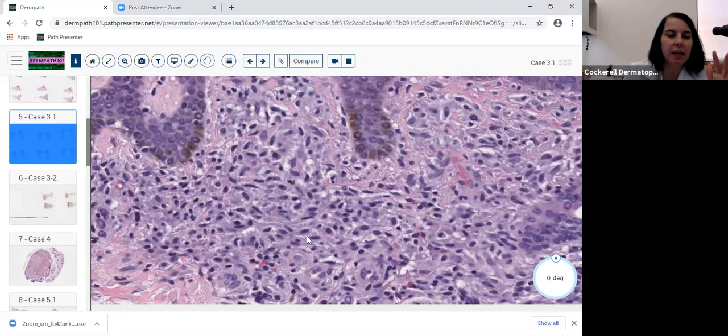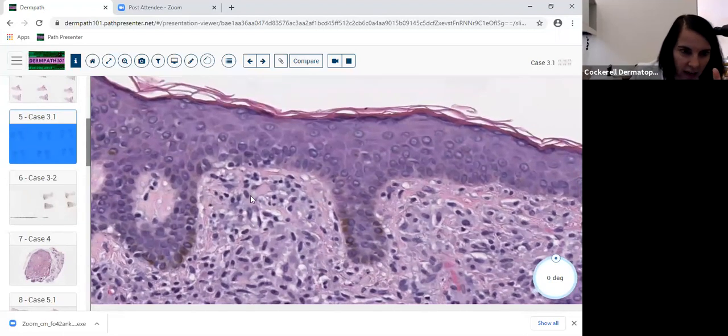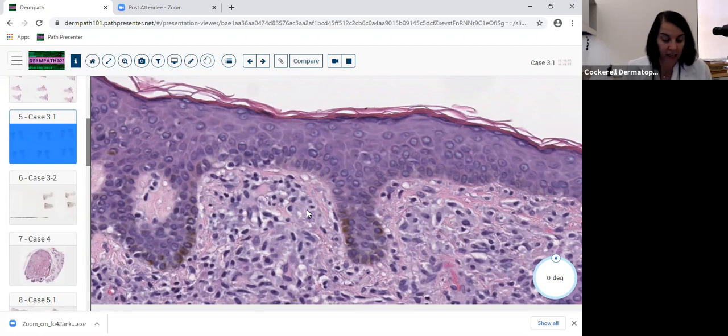And obviously you can see bullous lesions in children. You don't want to forget about the bullous lesions. Occasionally you'll see a cleft occur and you'll see the mast cells beneath it. So you can have different variations of this.